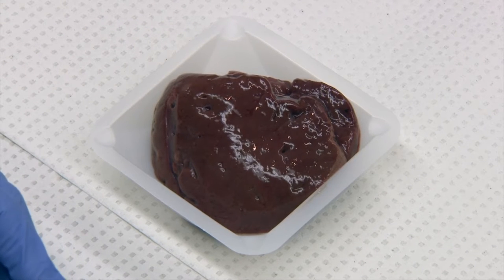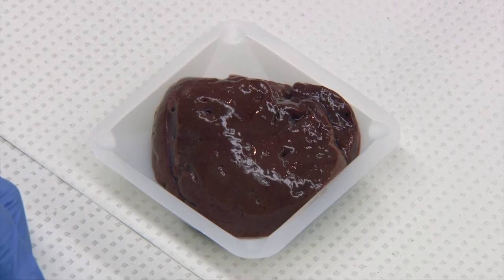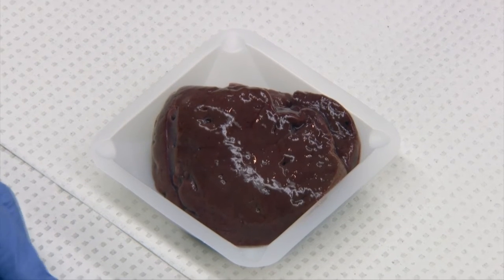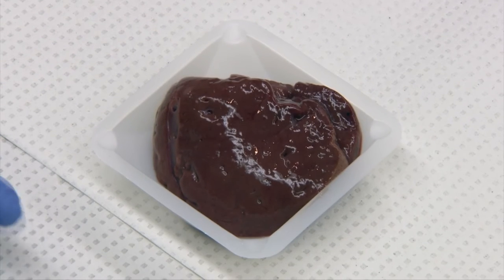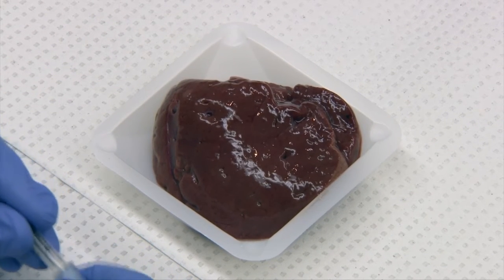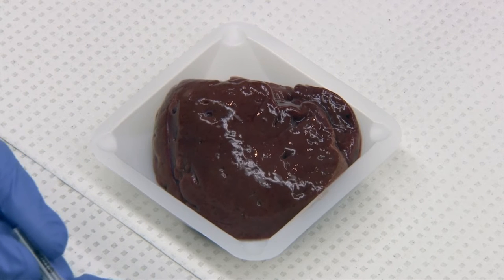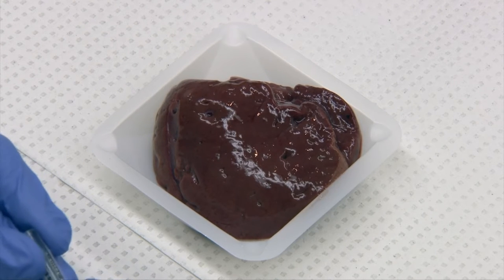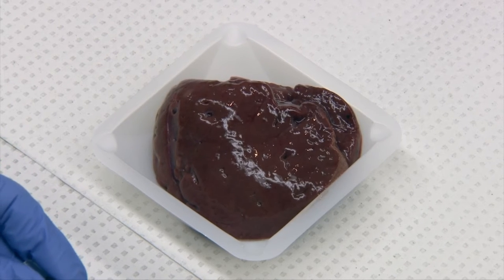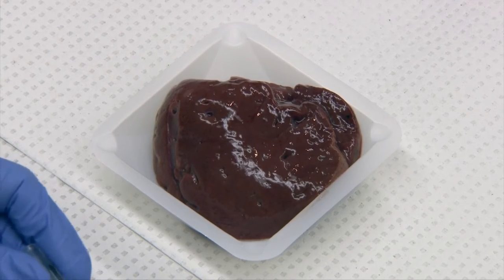The next method we wanted to show you was the non-aspiration capillary fine needle sampling. For this, all you need is a needle — I have a 22 gauge needle here — and this can be done to try and decrease the amount of blood contamination when you're sampling a tissue. For example, lymph node is one tissue that lends itself well to this technique.